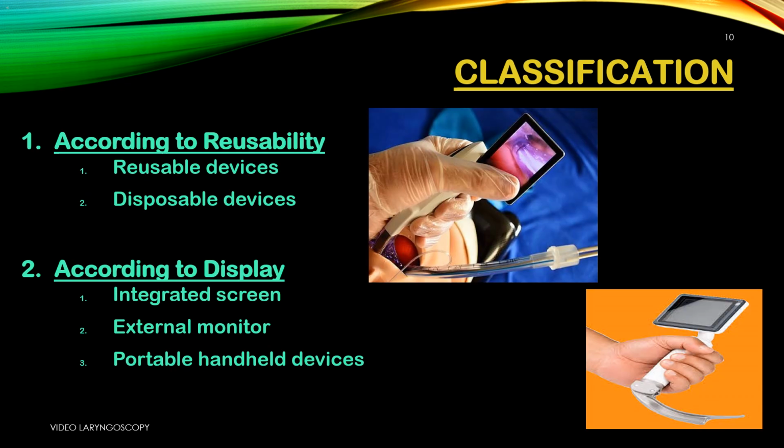Classification. According to reusability. 1. Reusable devices. Sterilized and used multiple times. Cost-effective long-term but need proper cleaning and maintenance. 2. Disposable devices. Single-use only. No cross-contamination risk. Perfect for emergencies, isolation cases, and field use.